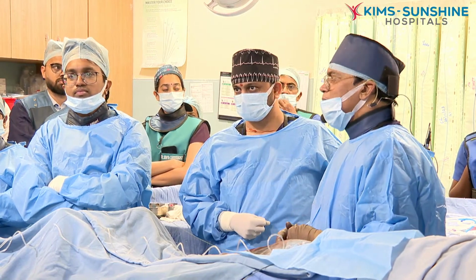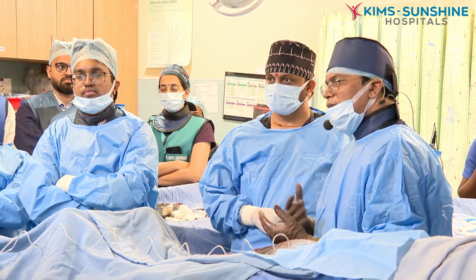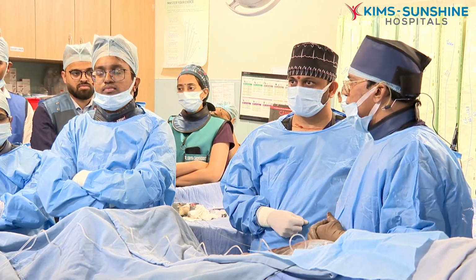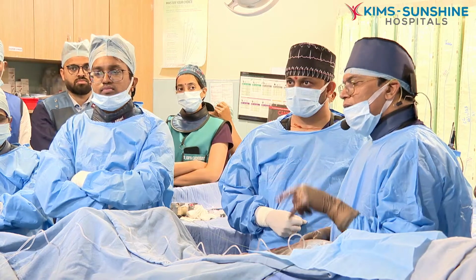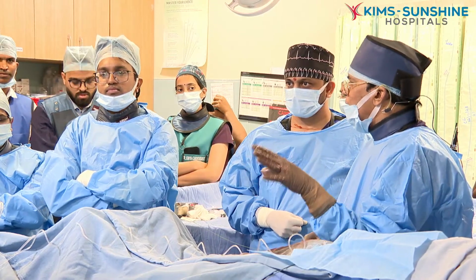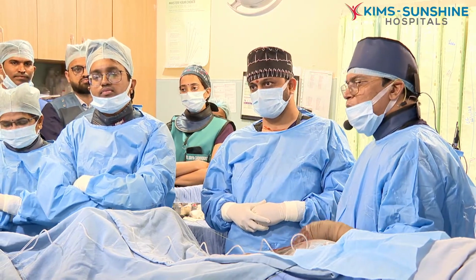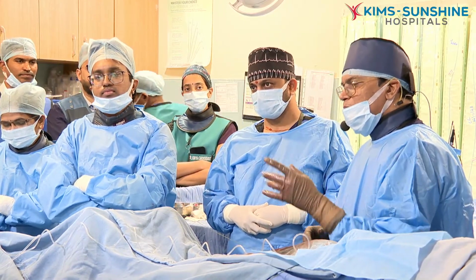For this case also we thought about whether to choose orbital atherectomy. We have been using orbital atherectomy consistently in the recent past, but for the calcium nodule we wanted to do the ROTA Pro and see how it helps, how it is going to modify the calcium nodule. But even today we have enough experience.